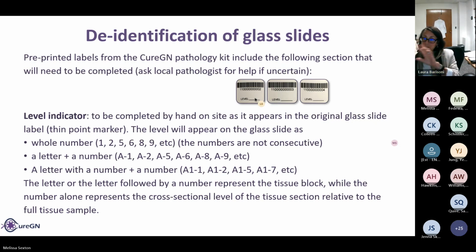You will have maybe a barcode, or maybe not, but people are moving to barcodes, the patient's name, the surgical pathology number, and then you will have the stain, and the block, which is generally A or A1, and then the level, 1, 2, 3, 4, 5. Each place is a little bit different. So the best thing is to go to your pathologist and ask them, show me what the block indicator is, what the level indicator is, where do I find the stain? That's all you need to know. And the patient's name, because you need to match it.